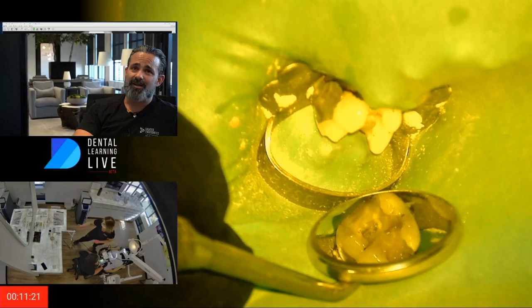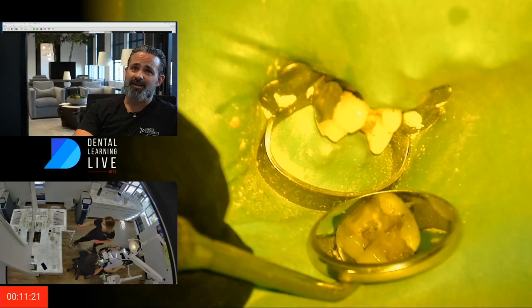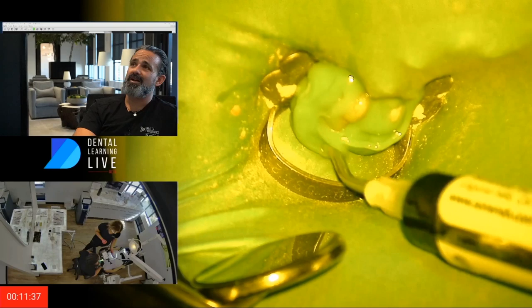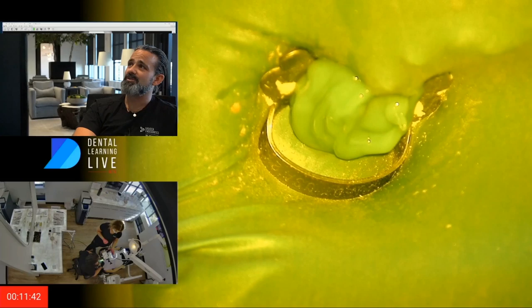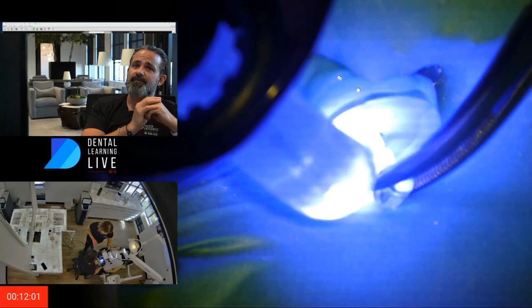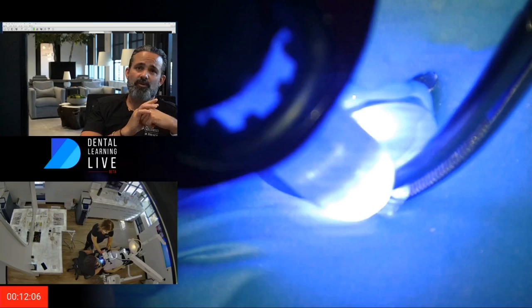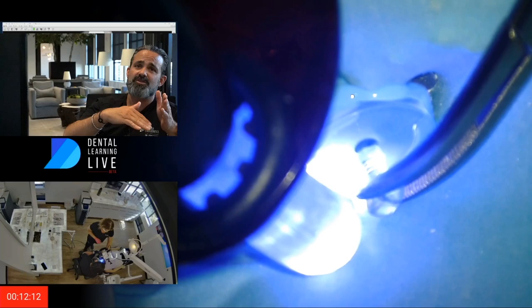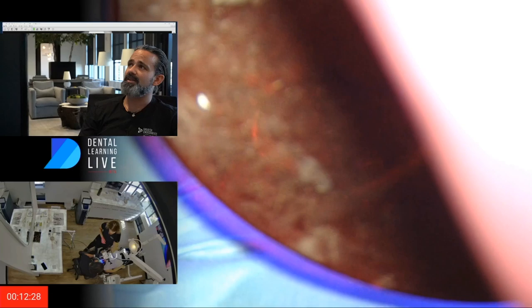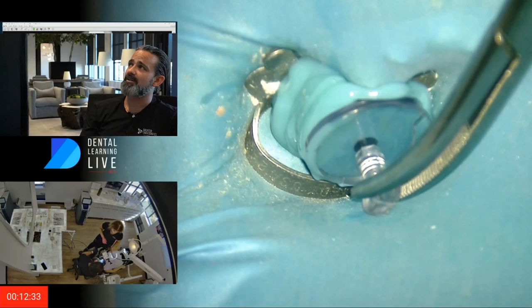I don't know if I'm going to access into that alloy or not. I may change my mind if I drop into my access and I'm looking at an alloy wall — that would be a different game. It seemed free and clear on the cone beam, so now I'm going to fill it up and make my mud pie — it's like making a sandcastle with sound seal. All I'm doing is getting basic retention box form, and what's nice is it's just easy to connect everything together. If you're worried about the depth you could do a pre-cure, and I've done that — it gives a little bit of resistance so the platform stays flush.